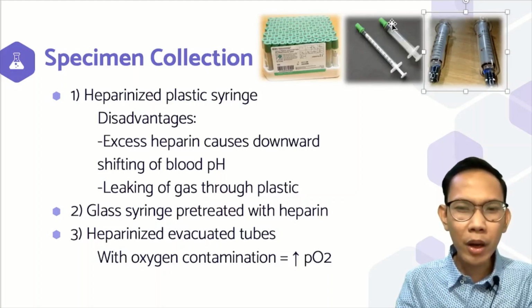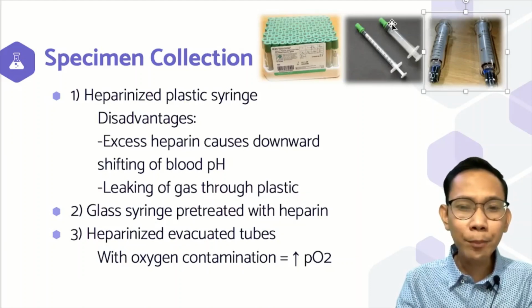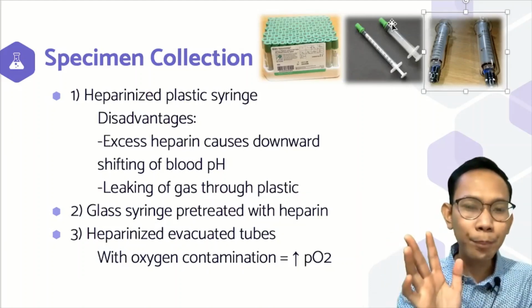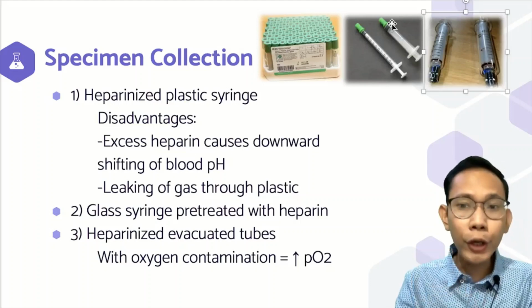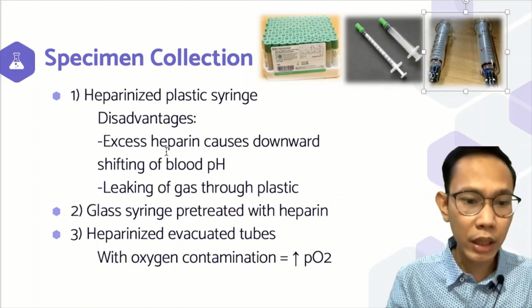Of course, now meron naman tayong mga respiratory therapists, no? So usually mayroong sarili nilang machines for reading those samples. So, meron din sila yun. So, depende talaga yan sa hospital protocol.